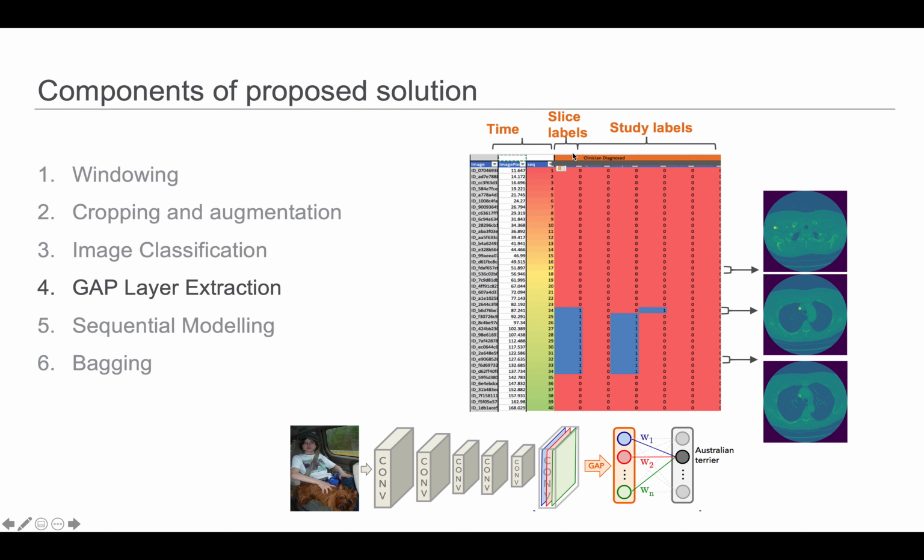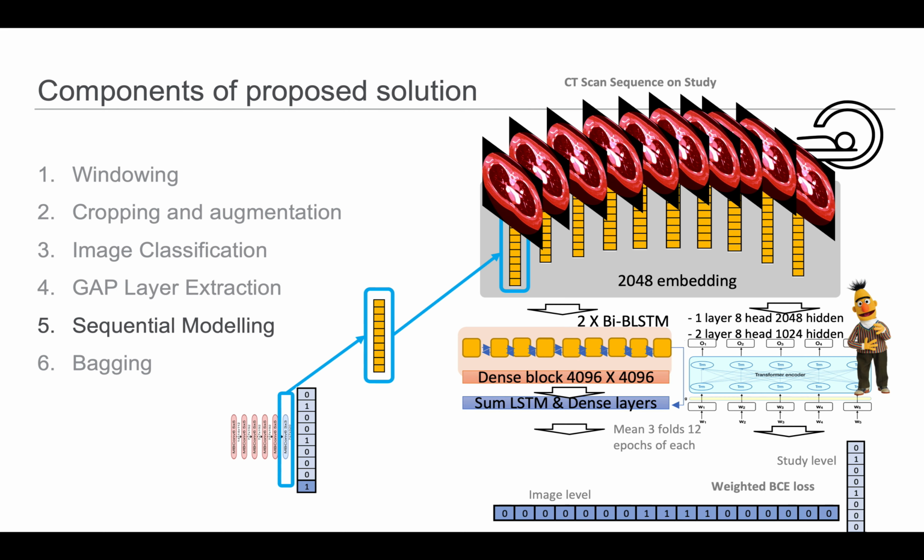If you take image classification, I showed an example where we have study labels. So for example, negative, and this would have the severity of the overall scan and whether the condition is on the right or the left side. Typically that's bunched together because the scan moves across from right to left. So it'll start seeing the same thing in a sequence of scans and then move off to the end where it doesn't see the condition anymore. So it's pretty useful to sequence up the features from all the images.